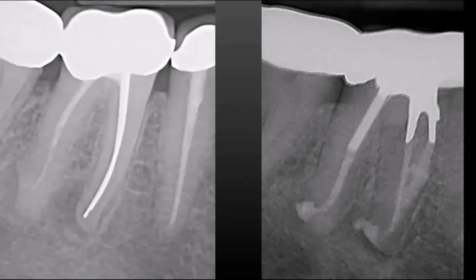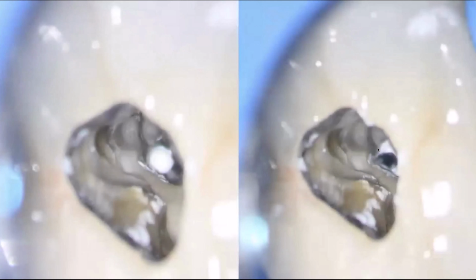So in this case, these are the types of ways of getting that anatomy filled in between the two roots of the teeth. So I'm fitting one main cone to the tip of the root, and then I'm using the backfill to build all the hydraulics and really push the sealer into that isthmus area. So in this case, basically I'm showing how I fill one, like let's say the MB1 canal is filled with sealer, then I'll use my plugger to push the sealer into that orifice to move it down into the canal system, and I'll use the Obtura to then squirt obturate and backfill the system.